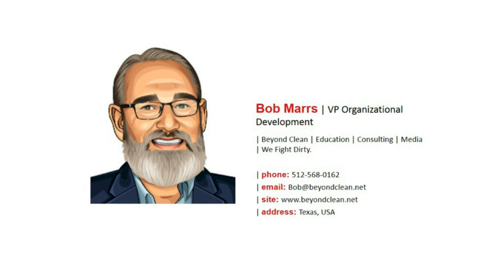All right, thank you. And Matt, I'm going to throw another one your way. There must be another way to process equipment, is this comment. Can you address this? Well, yeah, we come across a lot of people that say, well, there must be another way to do it. Unfortunately, there are other methods with steam or UV light to sterilize equipment, but this specific equipment that's being reprocessed is going to need some sort of chemical sterilant, right?